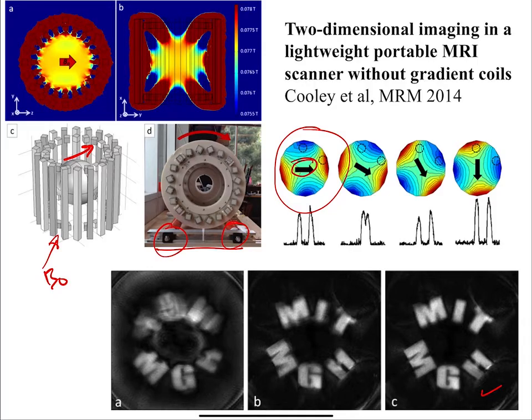The concept at least makes some sense. This would be a great application because, for example, you could literally think of someone riding a bike and turning this gradient, or hand cranking this gradient. You wouldn't need any power, hardly at all, except for the RF electronics.